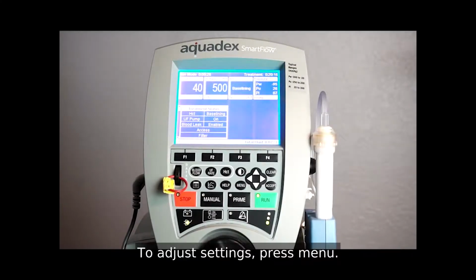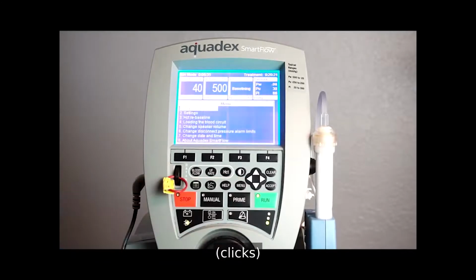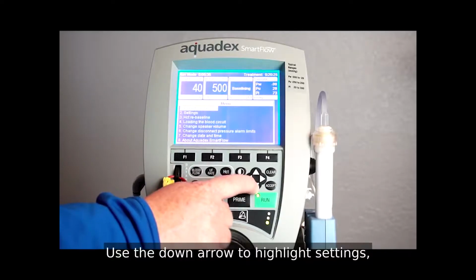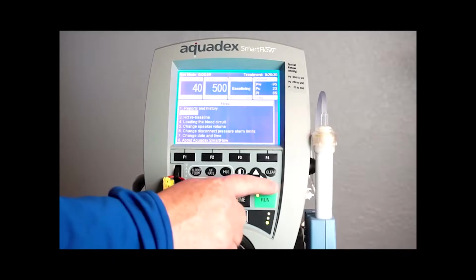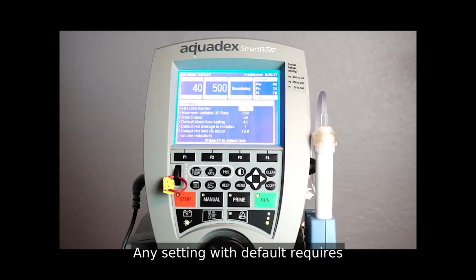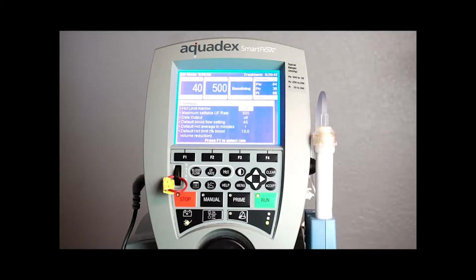To adjust settings, press menu. Use the down arrow to highlight settings. Press accept. Any setting with default requires a change, power cycle on off, then resume therapy for new setting to take effect.